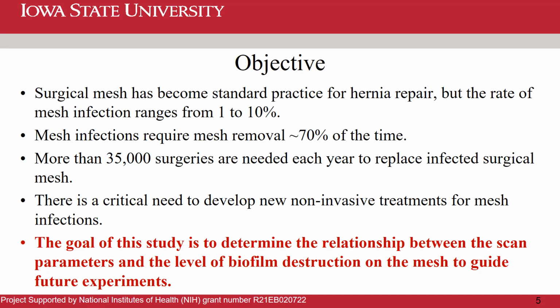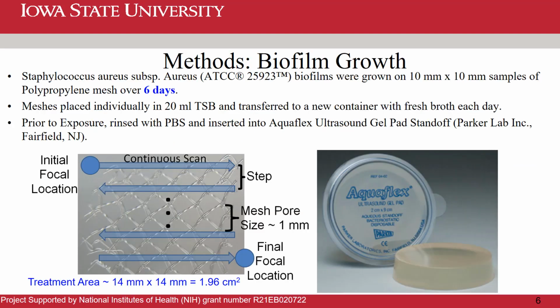Now, the goal of this study was to determine the relationship between the scan parameters and the level of biofilm destruction on the mesh to guide future experiments. Specifically, we would like to maintain efficacy, as we observed in our earlier studies, while at the same time reducing the time it takes to do the treatment.